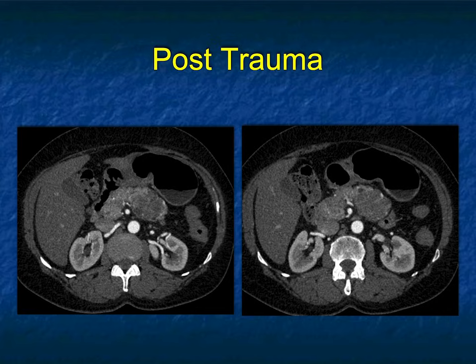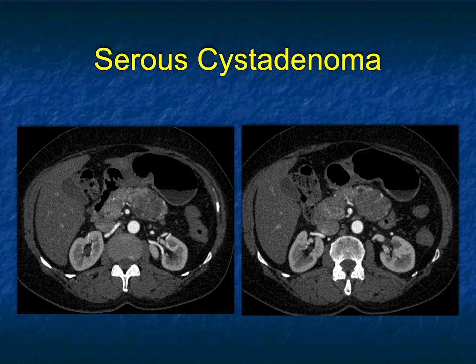This likely is just going to be an incidental pancreatic lesion. It's solid and cystic — depending on the patient's age you can think about things ranging from SPNP tumors to serous cyst adenomas, even theoretically an MCN. It looks like atrophy of the tail of the pancreas, and this was a serous cyst adenoma. When you're doing trauma patients, you've got to think about pancreatic trauma, but incidental pancreatic lesions ranging from serous cyst adenomas to IPMNs are not uncommon.